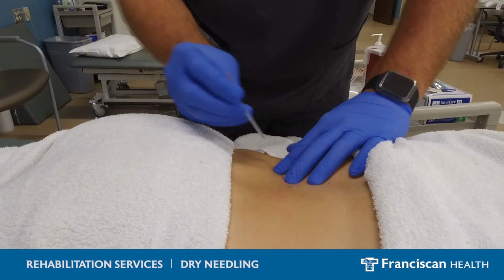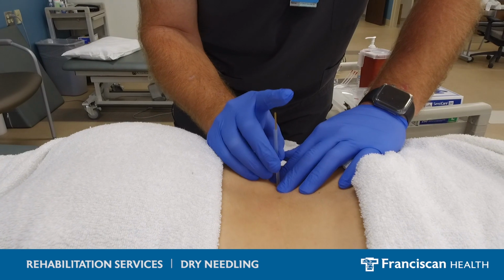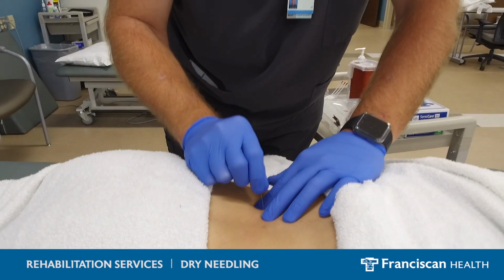I'm going to palpate. I'm going to poke around with my fingers and find where you have those tender spots. I'm looking for two very specific responses. It's that ache or that twitch, and it is a very quick treatment. A lot of setup, a lot of evaluation with hands-on and stuff, but the actual needle in the skin time is very short. Dry needling can be used for just about anyone that comes in the door. There's very few people that we don't do it to.